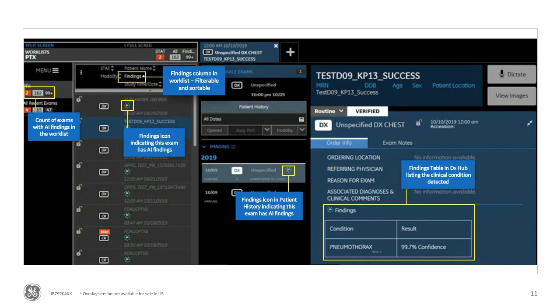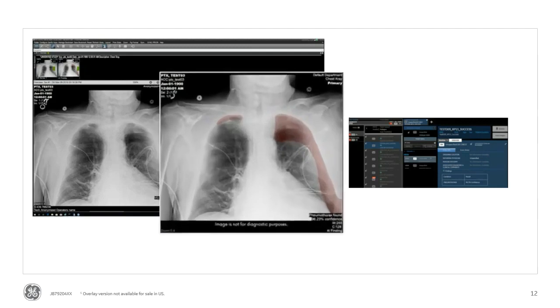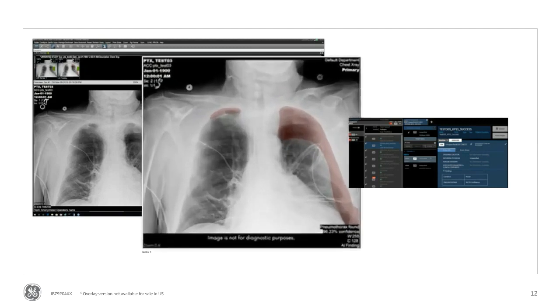Next, when the radiologist opens a case to read, the AI results can automatically be incorporated into the hanging protocols. This allows the AI results to be shown along with the current study, deployed as a secondary DICOM capture or by using the DICOM structured report standard, otherwise known as CAD-SR. In this example, we're seeing the probability score of a pneumothorax finding along with a heat map overlay showing the area in the lung at which it was detected.